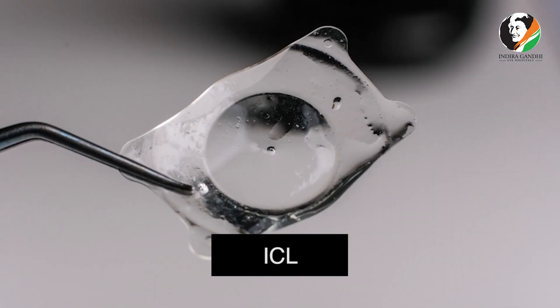If the patient is not suitable for LASIK, we have other options like ICL also, which is the process of implanting a very soft collamer lens inside the eye. By that also the patient sees very well and the visual recovery is very fast.